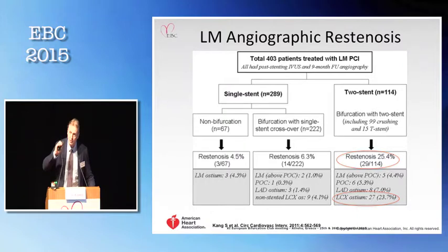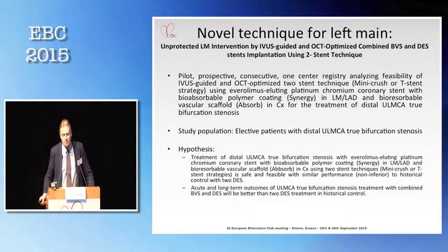And if there are no flow limitations, and as we know, if you do it with the right appropriate size, IVUS-guided cutting balloon interventions, you can make only very controlled dissections. And then we leave this with some GP2b/3a blockers, and actually with good results.